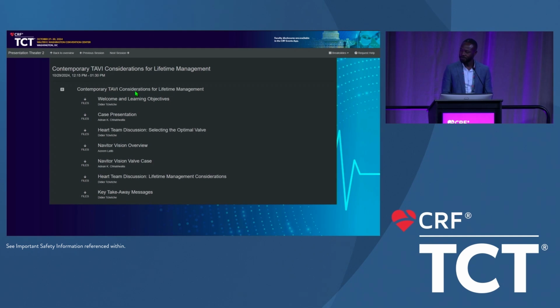And we've gone to look at them, and the majority were bicuspids that we did, where we were too much in this sort of minimalistic approach of doing a bicuspid patient. So we've changed our practice. When I do a bicuspid now, I'm doing it with TE guidance. I'm really making sure I'm getting the best possible result, because for a little while I underestimated the complexity of the anatomy, trying to be so minimalistic with my approach.